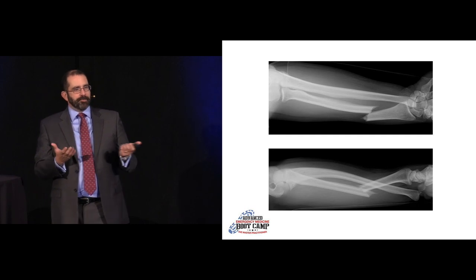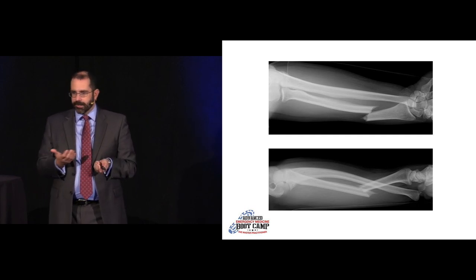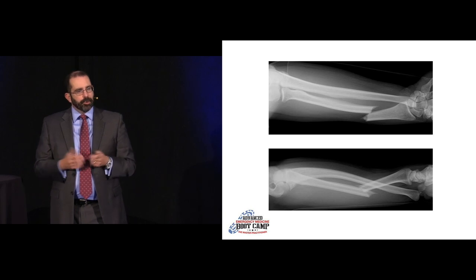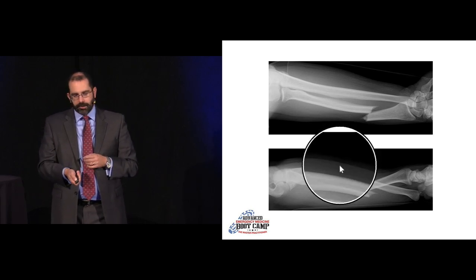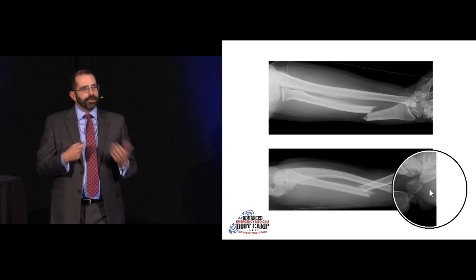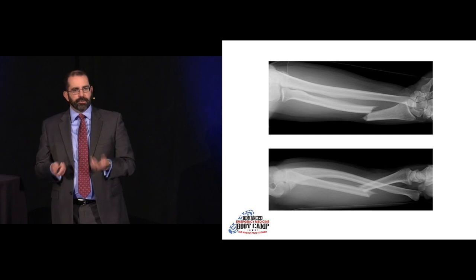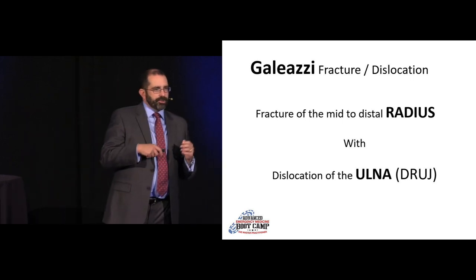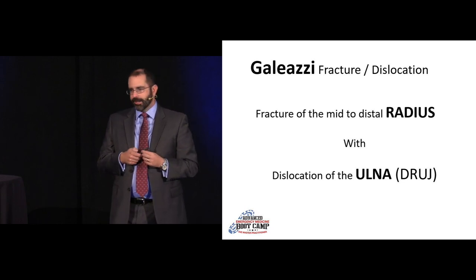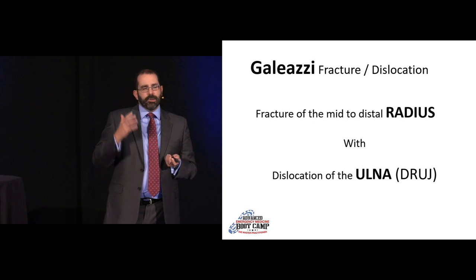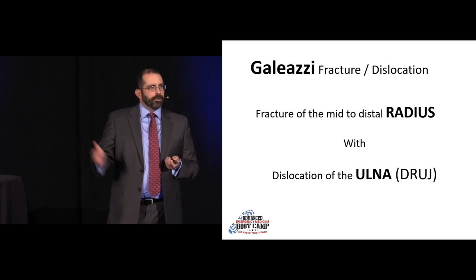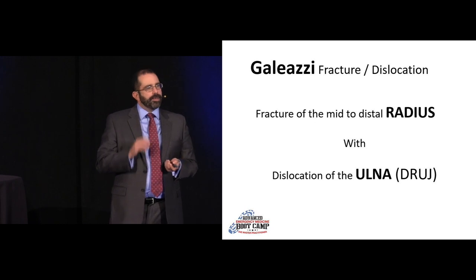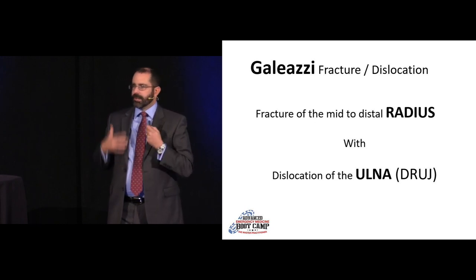This guy comes in after a rough day with a distal radius fracture — not too subtle. But remember, we have to pay careful attention to the DRUJ — the forearm is a ring and it's hard to break it in just one place. When we look at the DRUJ, they're totally separated. So this is not just a distal radius fracture but also an ulnar dislocation — a Galeazzi fracture-dislocation. A Galeazzi is a fracture of the mid-to-distal radius with a dislocation of the ulna or DRUJ disruption.